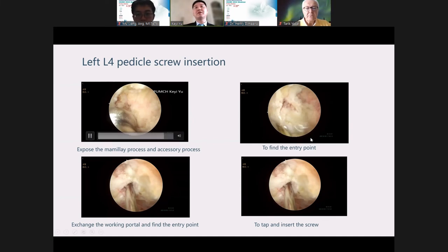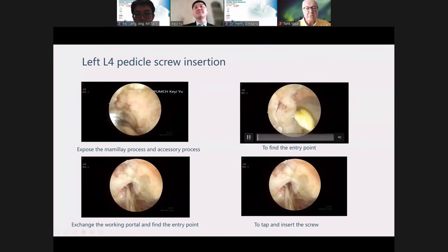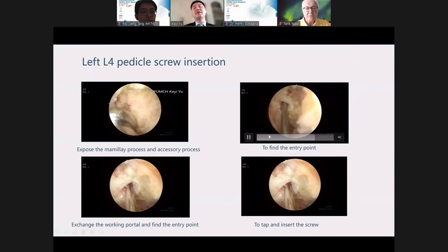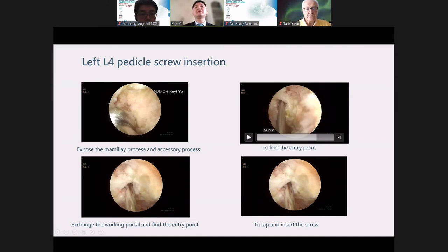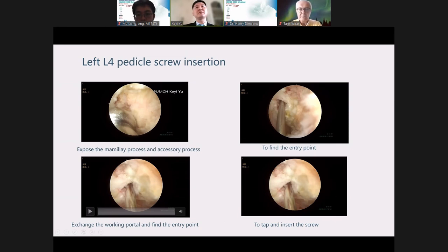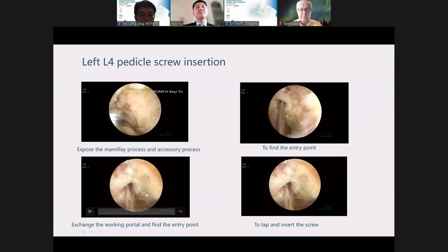We use a burr to enlarge the working space. Now we use an awl to make the landmark. After making this landmark, we can easily find the entry point. I put the guide wire through this landmark. As explained before, the A portal is the upper portal for scope and the B portal is for working. If I want to insert the pedicle screw, I exchange the portals — A portal is now for final screw insertion. I can see the guide wire and find the landmark very easily.